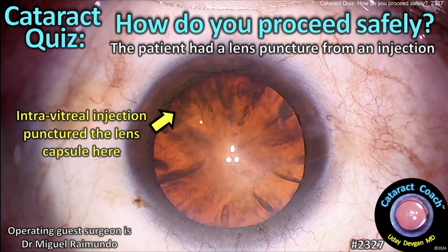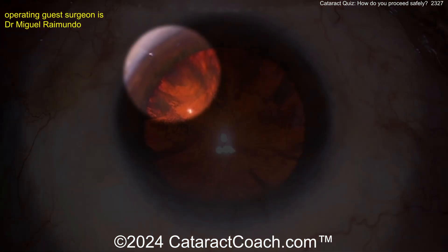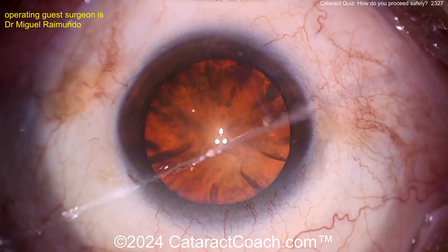CataractCoach.com cataract quiz: how do you proceed safely? The patient had a lens puncture from an intravitreal injection. There's a pre-existing puncture of the lens capsule, and now you have to do the cataract surgery. What are you going to do? This is going to be a tough case.